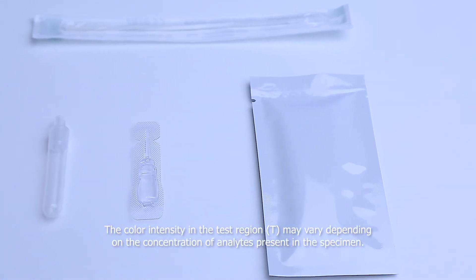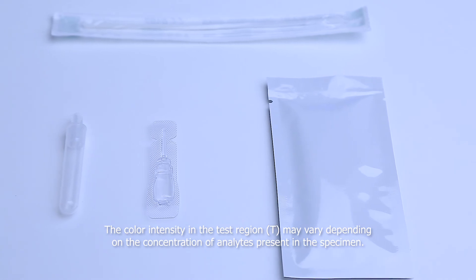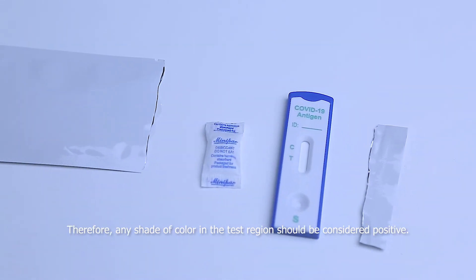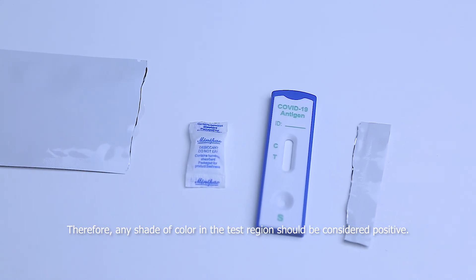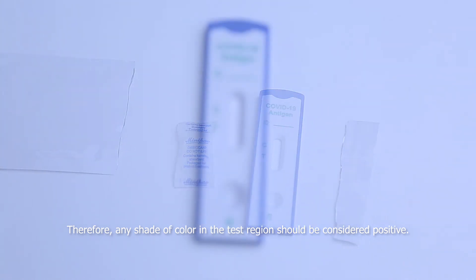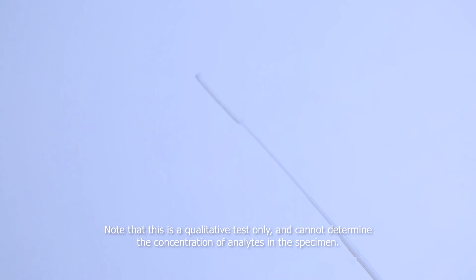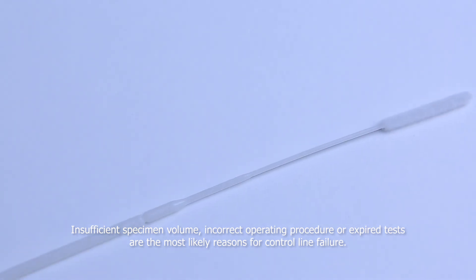The color intensity in the test region may vary depending on the concentration of analytes present in the specimen. Therefore, any shade of color in the test region should be considered positive. Note that this is a qualitative test only and cannot determine the concentration of analytes in the specimen. Insufficient specimen volume, incorrect operating procedure, or expired tests are the most likely reasons for control line failure.